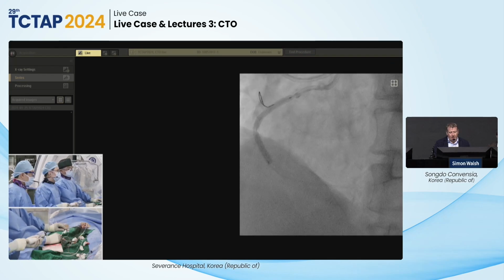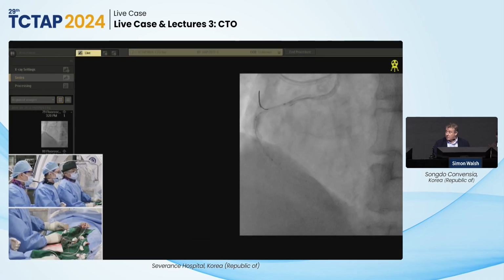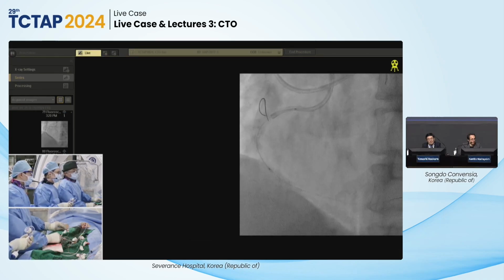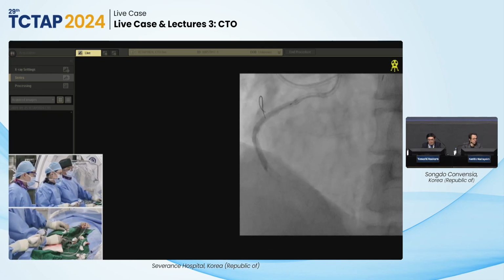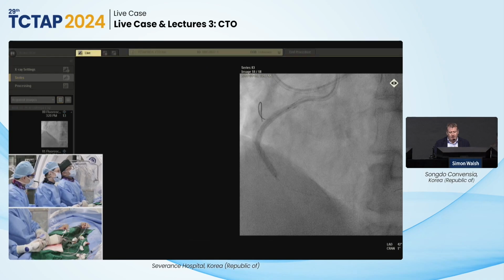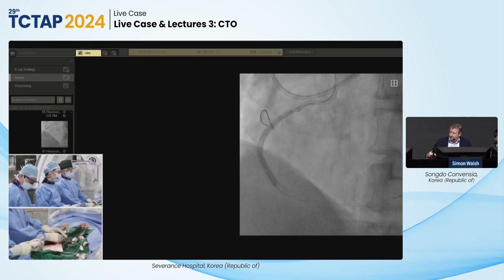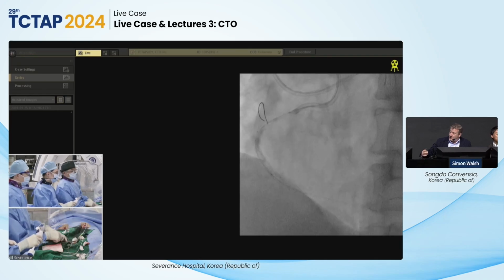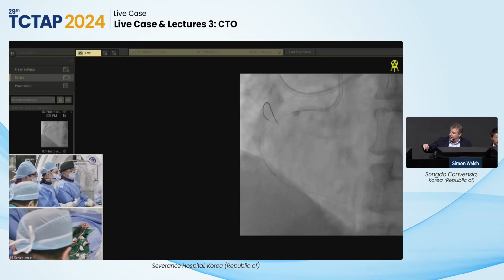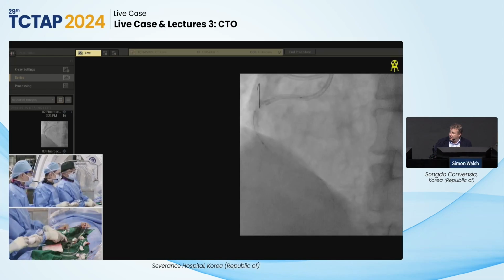And that's that little area of eccentric calcification. But are you sure that with atherectomy you always really get it destroyed? I mean, you have wire bias, right? You probably would need a really large burr to get that modified. It depends. I think sometimes we think about that a little bit wrongly. I actually think that the degree of protrusion is probably a more relevant aspect in the nodules, rather than where the wire bias is or where the IVUS catheter goes. So often you'll see the nodule so protrusive that it'll touch the IVUS catheter even if it's on the opposite side of the vessel. And I think in those circumstances, atherectomy will still do something useful.